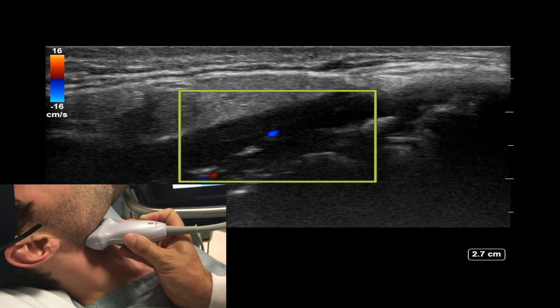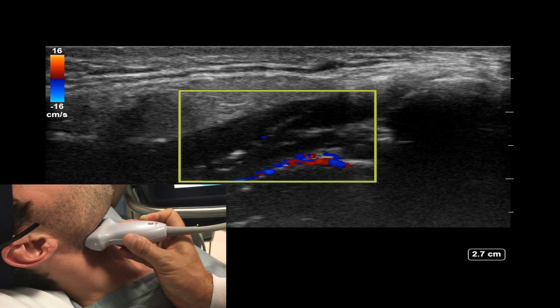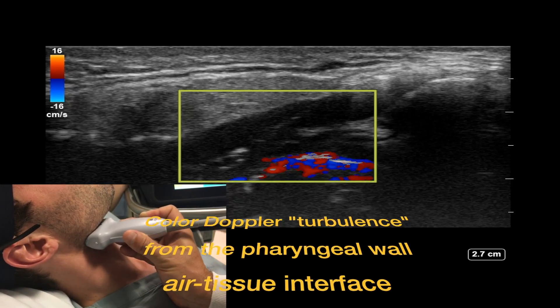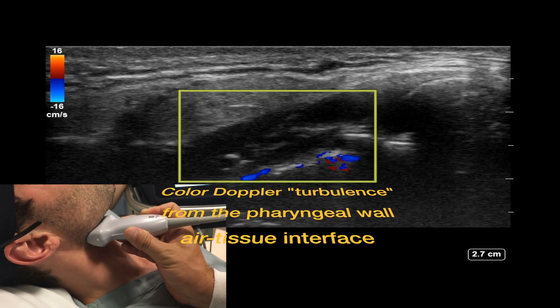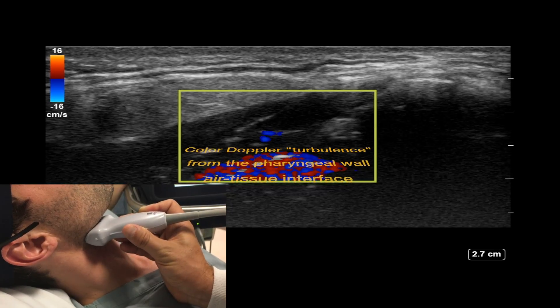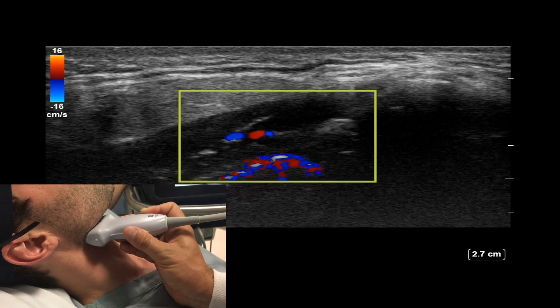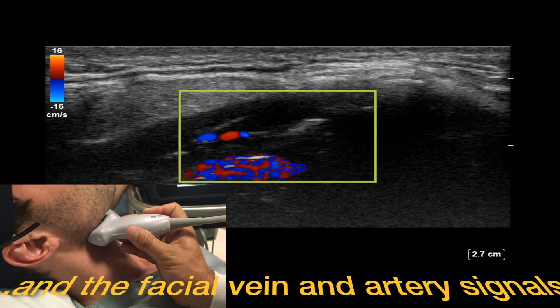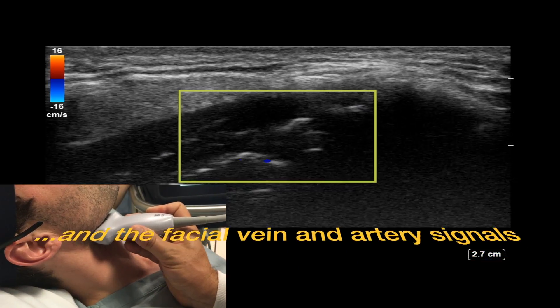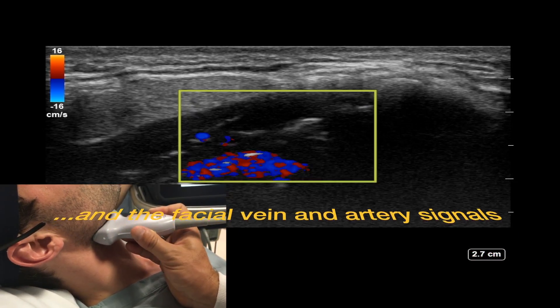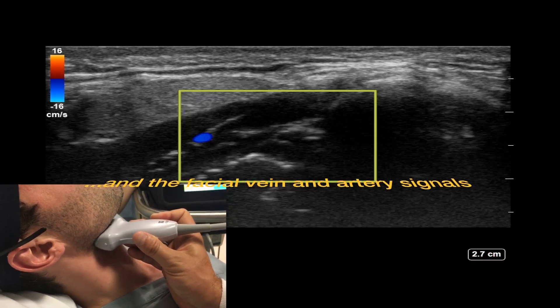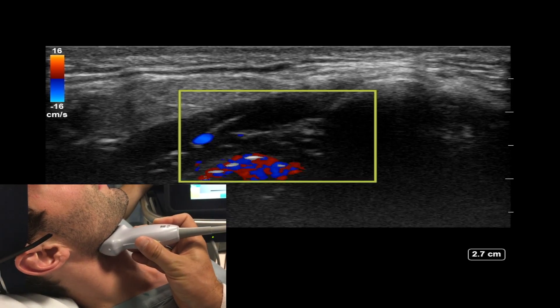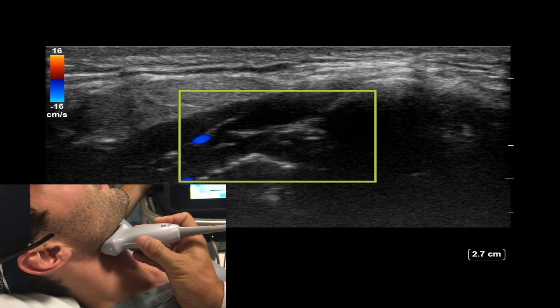Adding color Doppler allows us to visualize the turbulence artifact from the tissue-air interface of the pharyngeal wall, as well as the signal from the facial artery and vein. Depositing small amounts of local anesthetic just superficial to the pharyngeal wall will block the distal glossopharyngeal nerve.